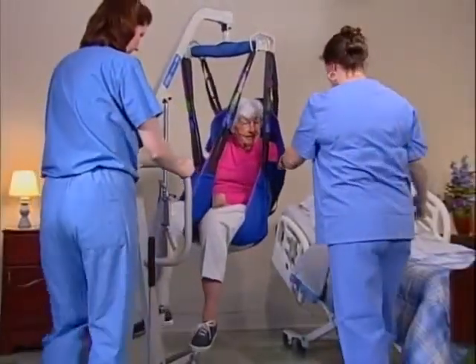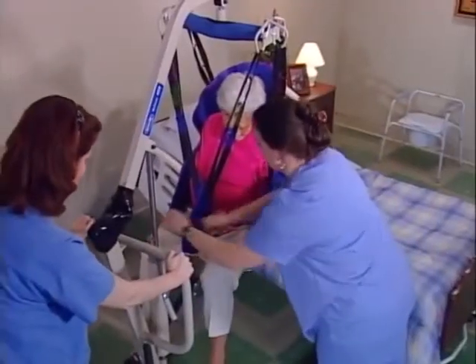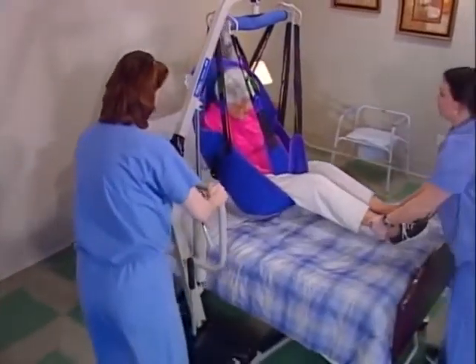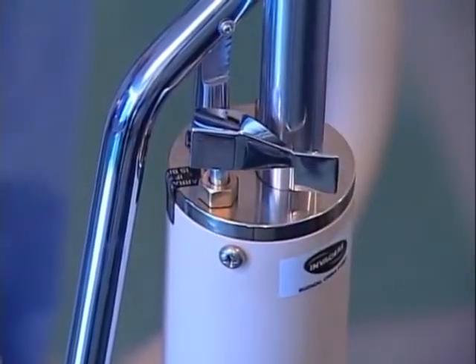Move the lift towards the bed and position the resident over the middle of the bed. Then, rotate and position the resident properly above the bed. Lower the resident on the bed by turning the control valve counterclockwise.